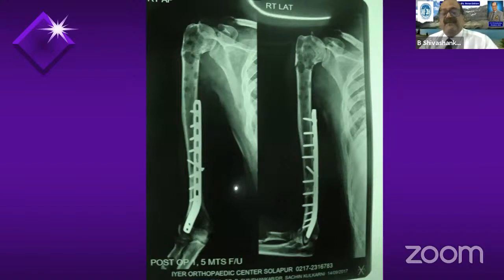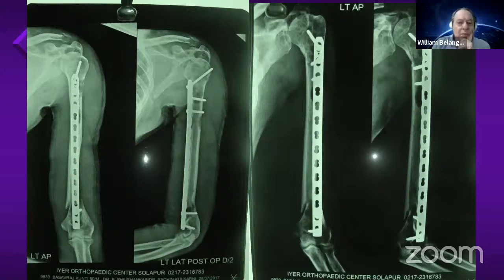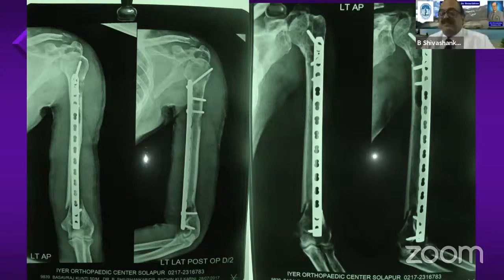But what I did was, as Belangero said, I used oblique screws to get some hold. I took out this distal plate and added this. This is how I treated this patient. This is the final result I have, because subsequently the patient never came back to me. What happened to him, I don't know. This is about 2 or 3 months after my initial treatment. It is the last X-ray I got.